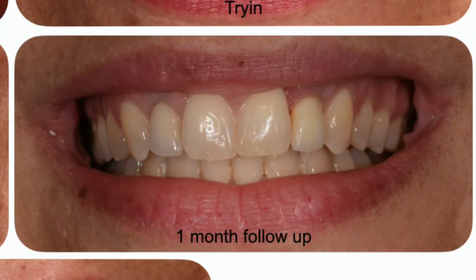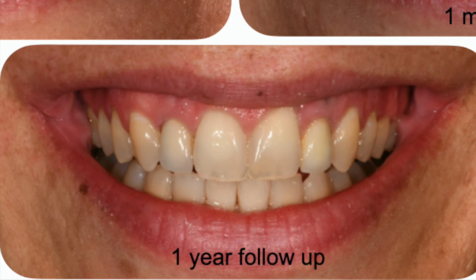Here you can see at a 1 month follow-up, what are we getting? We're getting soft tissue proliferation around the new contour of the critical and subcritical areas. And we're getting soft tissue filling in. We're getting a nice semi-lunar free gingival aspect, and we're getting papilla fill. This is now a 1 year follow-up. Look at the migration of the papilla and look at the semi-lunar contour of the soft tissue. It is ideal, all because the emergence profile of the abutment and crown were there. And we have good buccal bone and good interproximal height of bone.